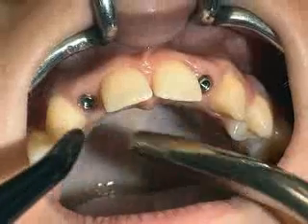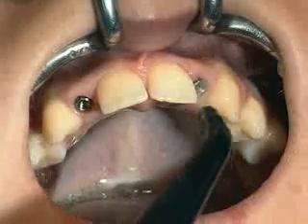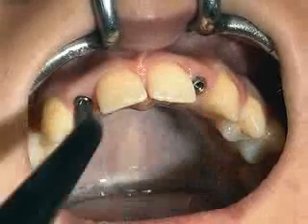By the time the healing caps are removed, the aesthetically critical emergent profile of the gingiva is fully developed.